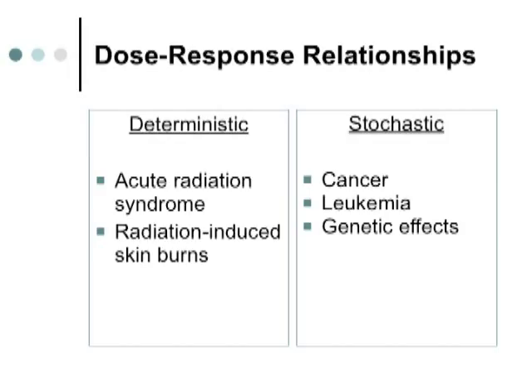Okay, so deterministic effects are usually the result of acute radiation exposure, and happen to everybody if you're given the proper amount of radiation. The amount of radiation that it takes to produce a given effect, we call that a threshold, below which you won't see that effect. Okay, so erythema has a threshold of 300 rads. Epilation has a threshold of about 300 rads, where your hair will fall out. Cataract has a threshold of an acute exposure of about 50 rads of radiation.